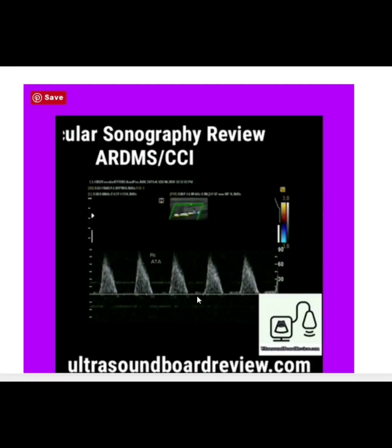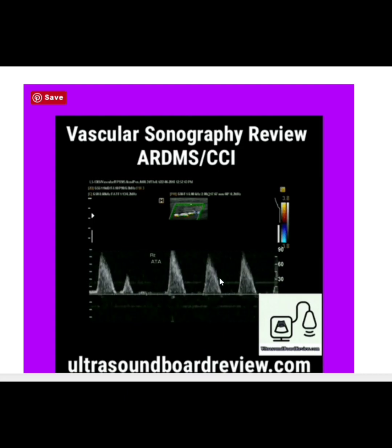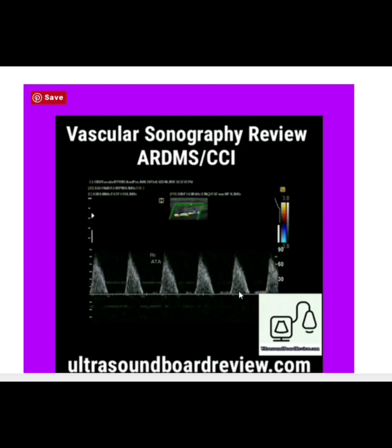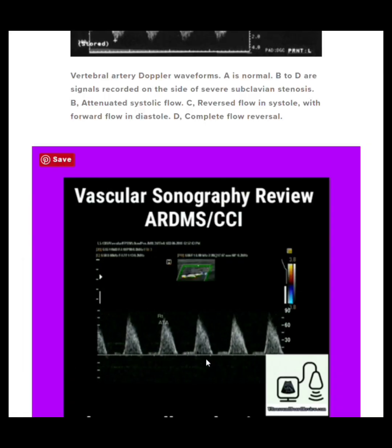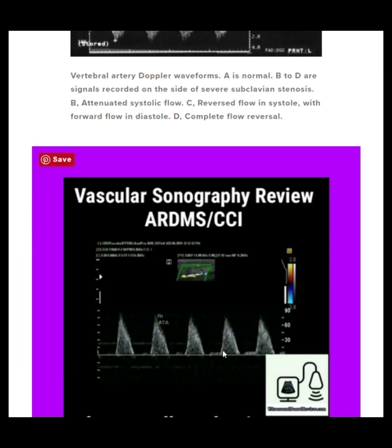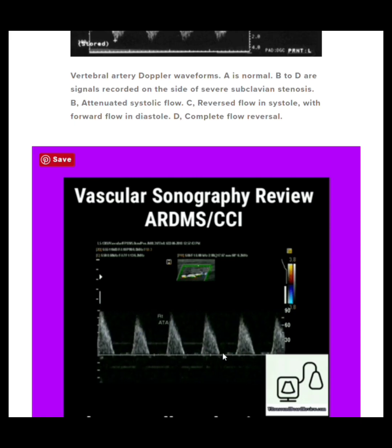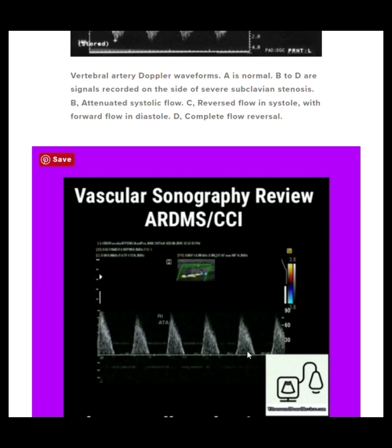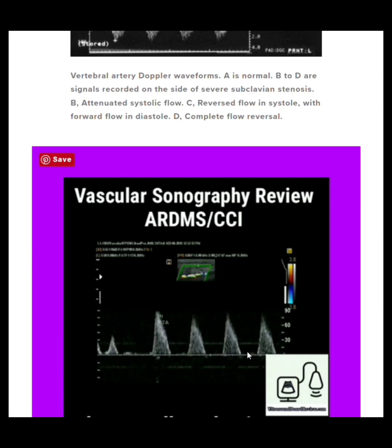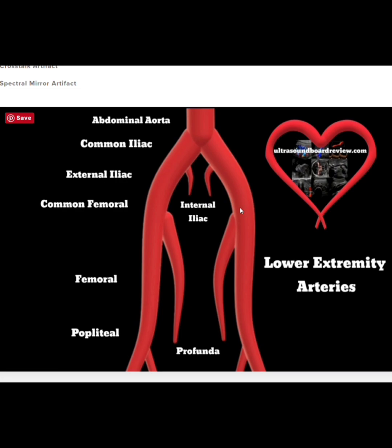This waveform is considered monophasic with high velocity, high resistance flow and very little to no flow during diastole. We know it's monophasic because there's no flow reversal below the baseline. Because it's monophasic with little diastolic flow, this indicates you are evaluating the disease downstream or distal, and the disease is upstream or proximal — so if you're evaluating this area, the disease is further up, which is upstream.